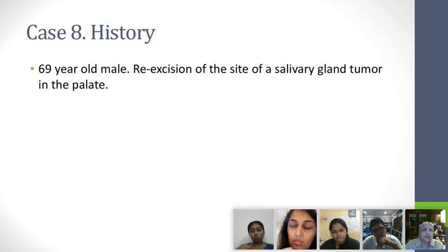When there's something called re-excision at the site, re-excision means what? That something was excised before and they feel that they haven't got it out completely, right? Particularly in the palate, if somebody wasn't expecting the diagnosis to be a salivary gland tumor and they went in and did a bit of an excision, and then they discovered that the margins were positive, or they weren't sure whether something had been left behind, then they go and re-excise that particular site. So that is what has happened in this particular case.